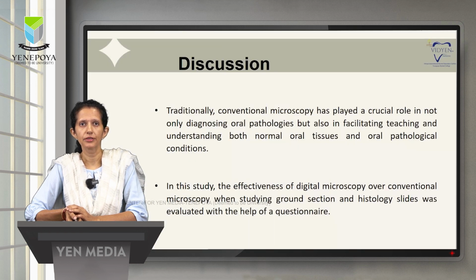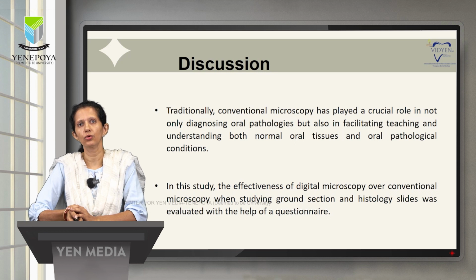Coming to the discussion, traditionally conventional microscopy has played a crucial role in not only diagnosing oral pathologies but also in facilitating teaching and understanding of both normal oral tissues and oral pathological conditions. In this study, the effectiveness of digital microscopy over conventional microscopy when studying the ground section and histology slides was evaluated with the help of a questionnaire.